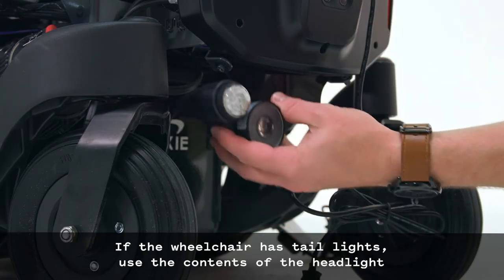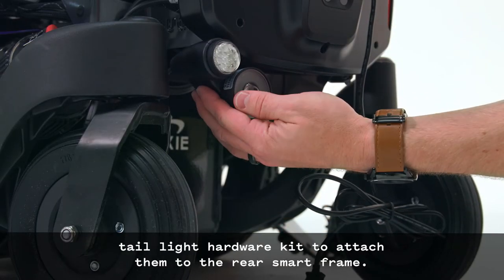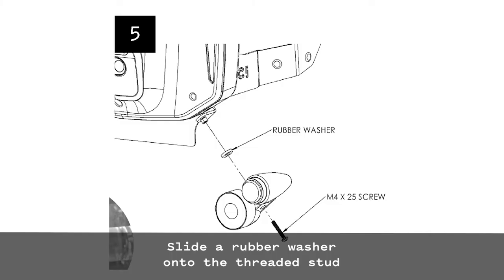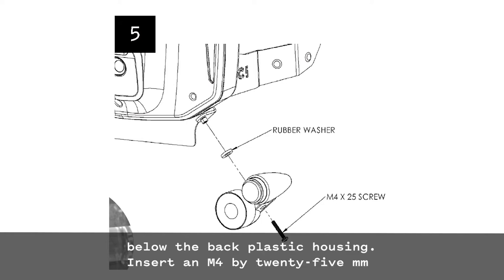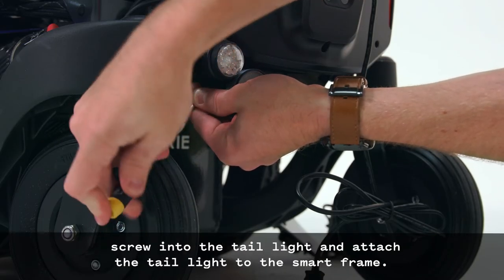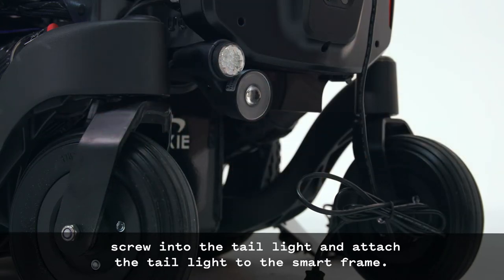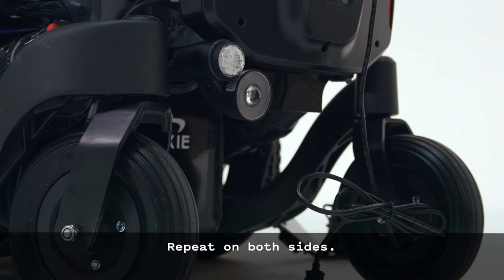If the wheelchair has taillights, use the contents of the headlight taillight hardware kit to attach them to the rear smart frame. Slide a rubber washer onto the threaded stud below the back plastic housing. Insert an M4 by 25mm screw into the taillight and attach the taillight to the smart frame. Repeat on both sides.